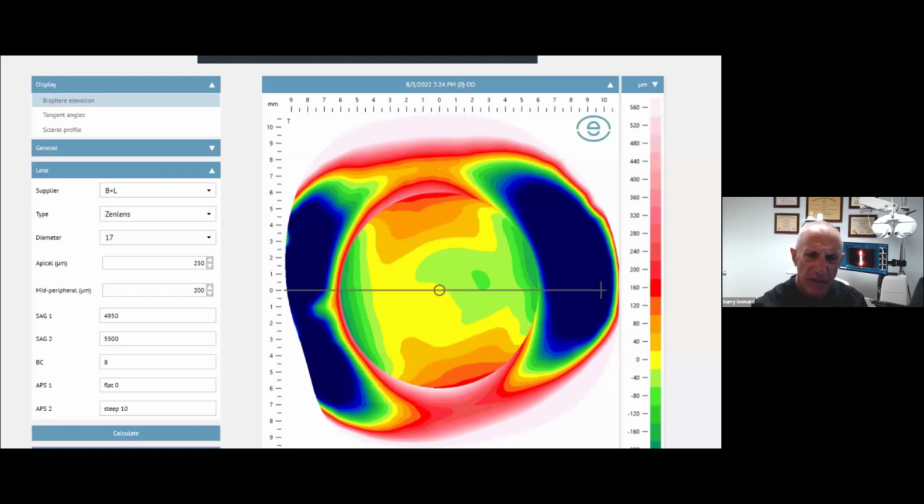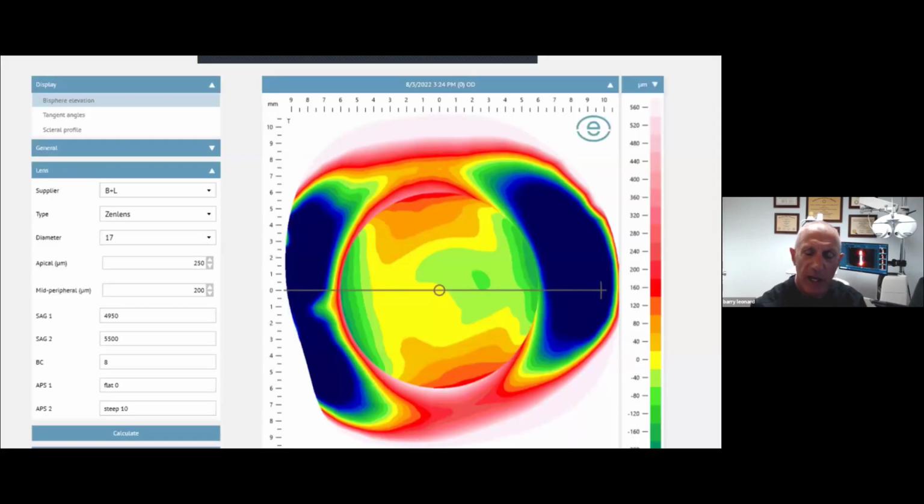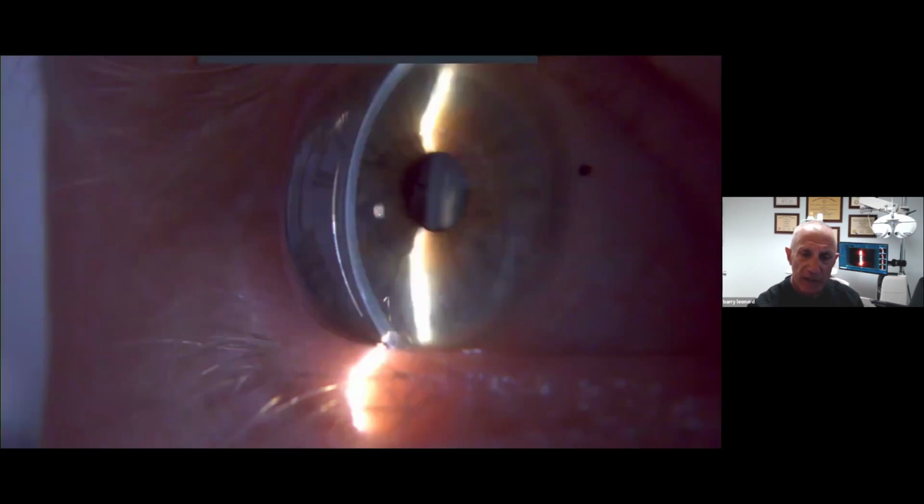And then this is again the second eye, and we did a similar thing, and there was that beautiful lens that we really found. And as you can see, it's a very against the rule sclera, which I believe we all know is usually a little more difficult to fit. We can't really hang that lens on for that superior inferior to keep that inferior decentration, but we're able to get this sitting just really nice.